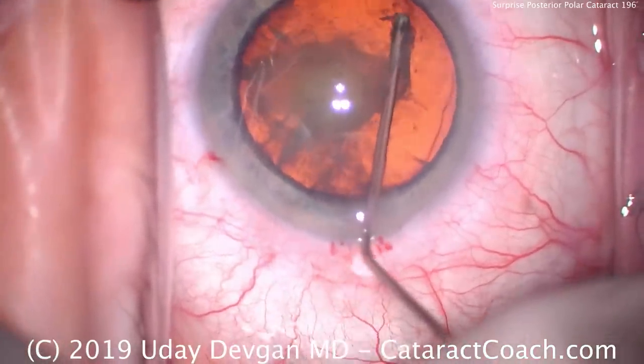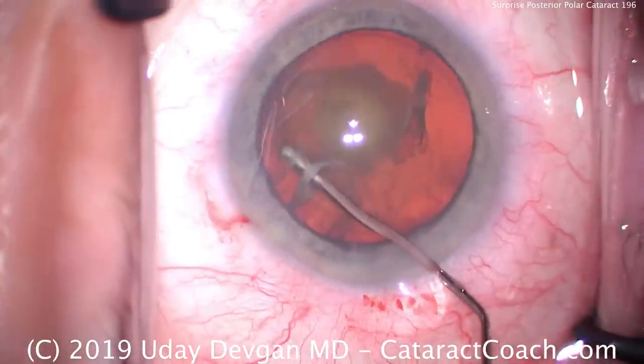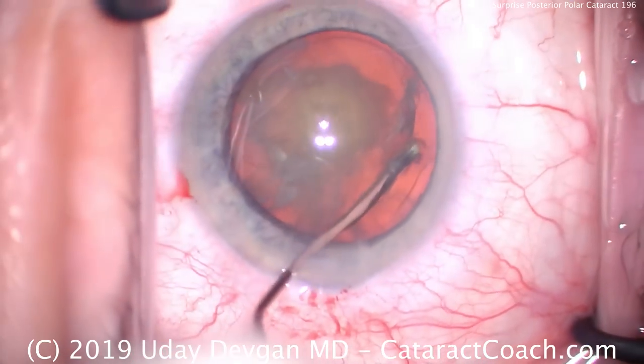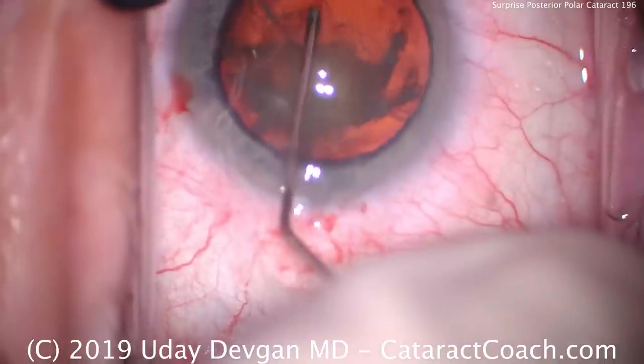The problem is, if you do hydrodissection and that fluid wave goes between the posterior capsule and that polar opacity, it can rip the posterior capsule open. So you definitely have to avoid that. No hydrodissection — just a little hydrodelineation.